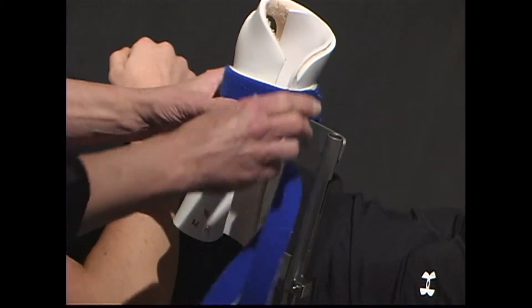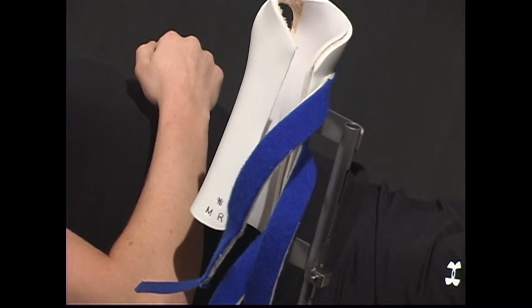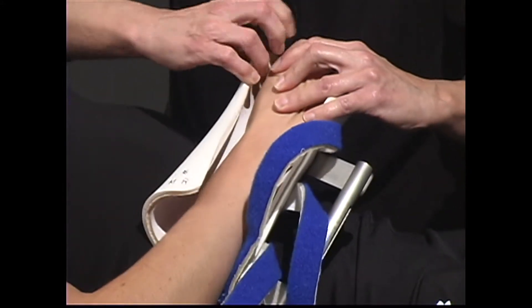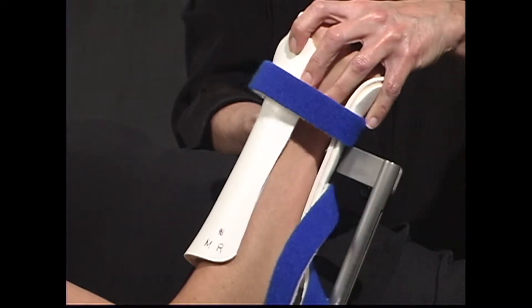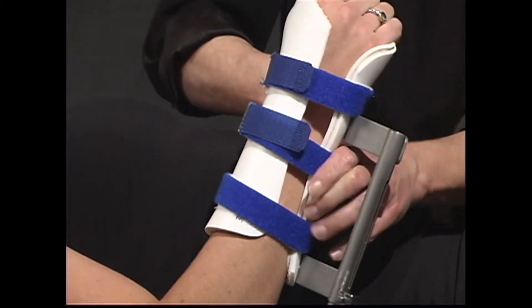Loosen the blue straps on the hand stabilizer and push the arm piece down to accommodate the patient's arm. Slide the arm piece to where the patient's thumb can be inserted into the hole of the arm piece. Feed the strap through the D-ring, pulling snugly and folding back on itself.